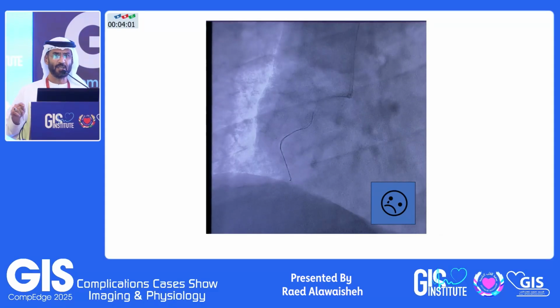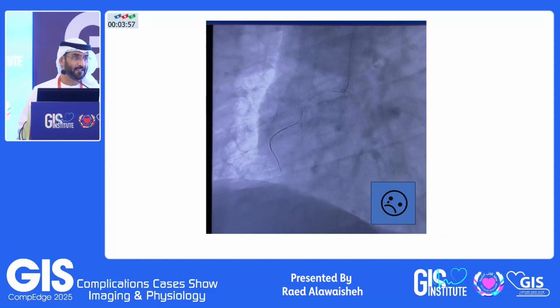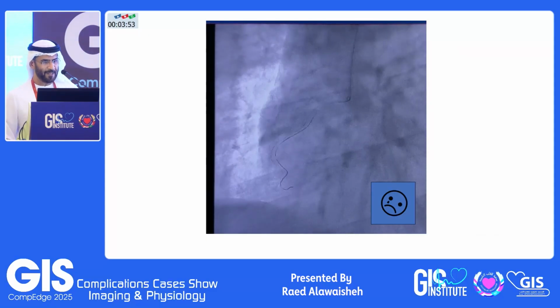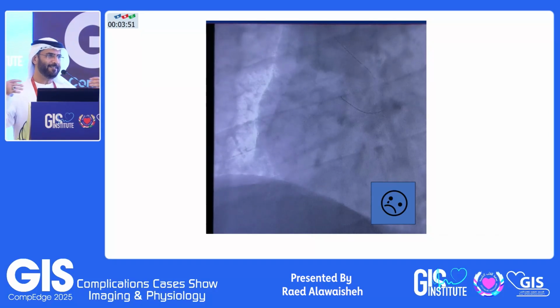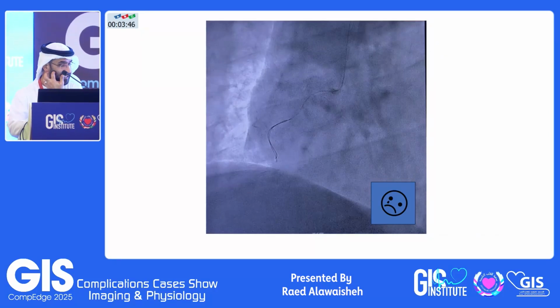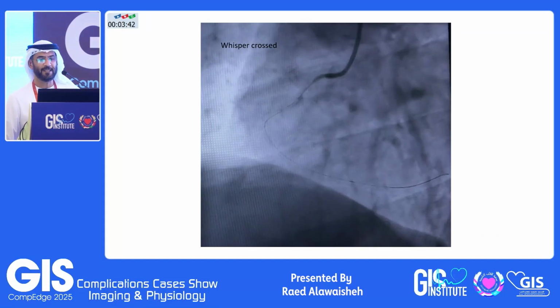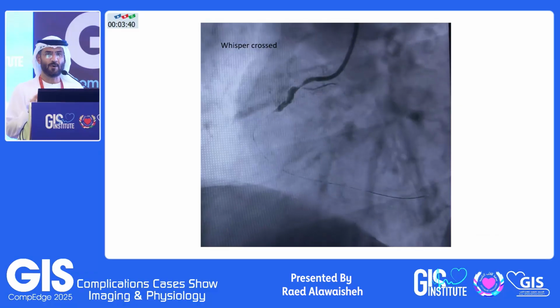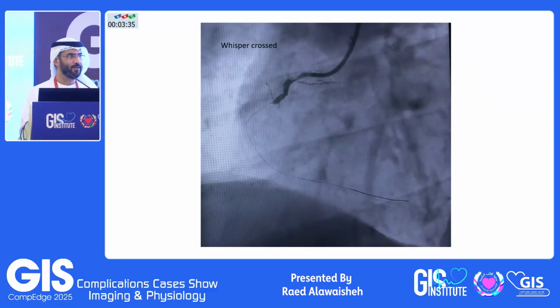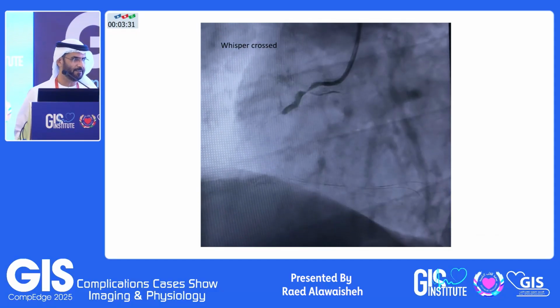To say, I know he's an acute myocardial infarction, his ejection fraction is expected, it's accepted, but this guy wants to rush the wire hard, then he wants to start from the beginning again. Actually, he was lucky, because next he will use a whisper wire, and the wire could pass through the lesion. Now, always, almost always, look at the distal wire's movement in a normal coronary or in any lesion.